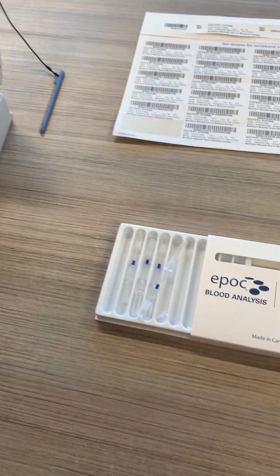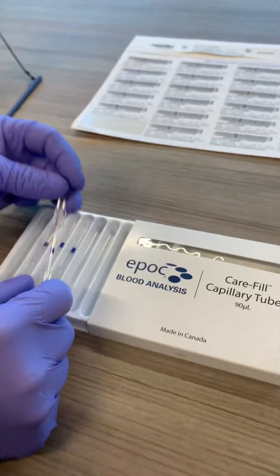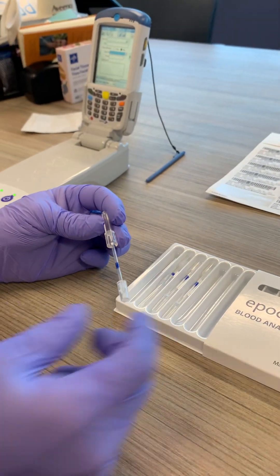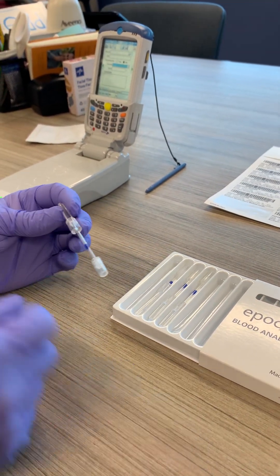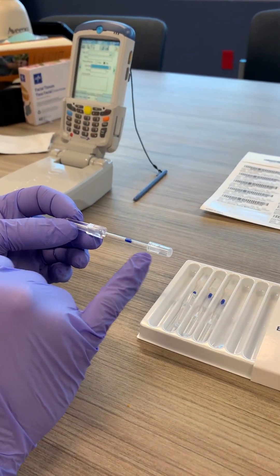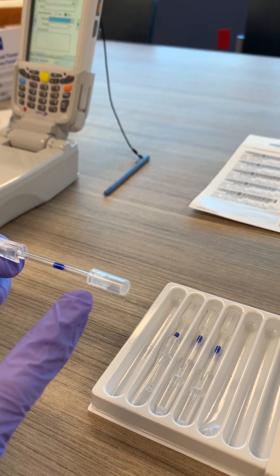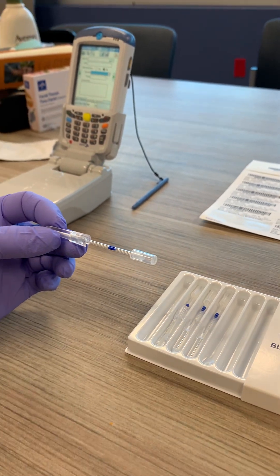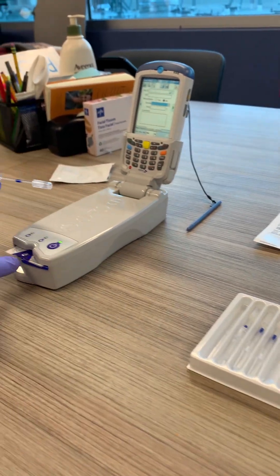First, you'll pull out your capillary tube. These will be found down in the laboratory. If we run low, you'll get another box from the laboratory. You'll see there are a few parts on here. This plunger is an important part right here. It's almost a preloaded plunger — it's kind of clear, so it's hard to see at this point, but it'll make more sense as we introduce the blood into the EPOC unit.